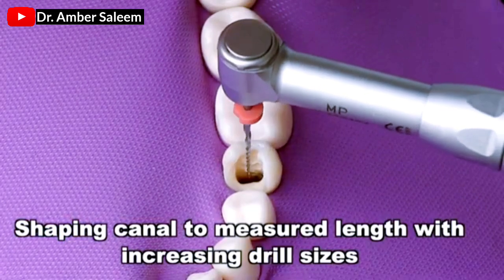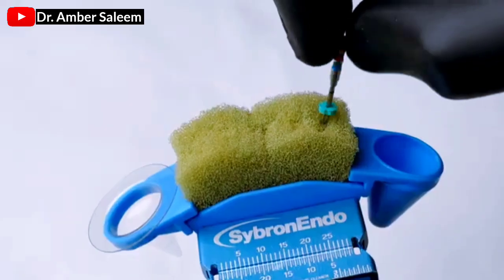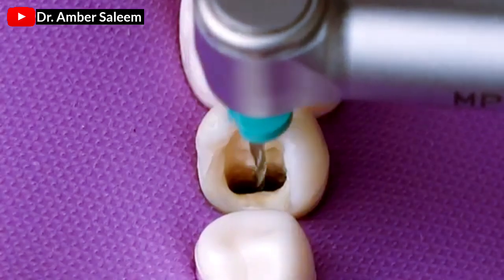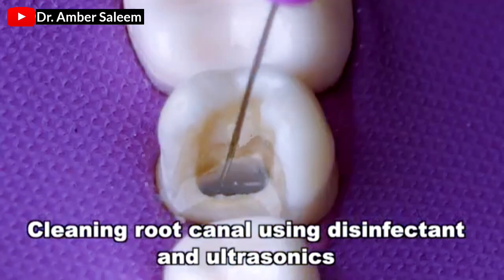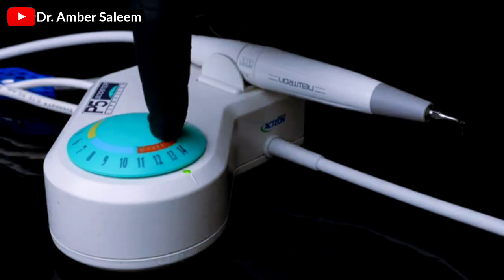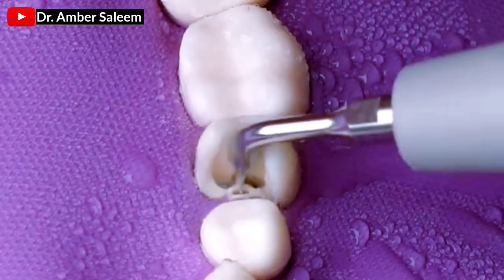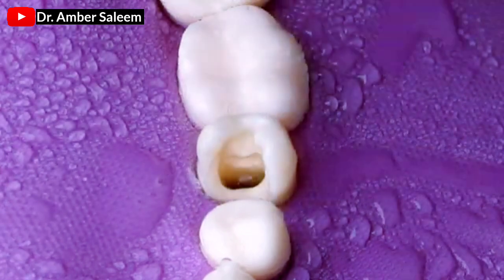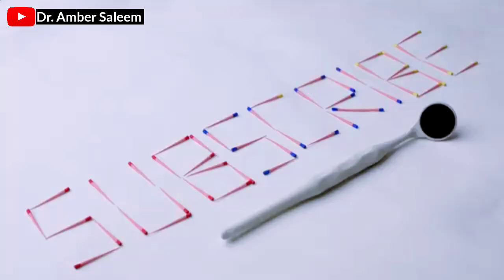Shaping canal to measured length with increasing drill sizes. Cleaning root canal using disinfectant and ultrasonics. Cleaning root canal using hypochlorite.